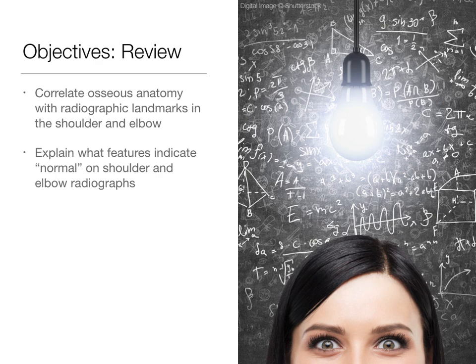So we finished our crash course on reading shoulder and elbow x-rays. This will take lots of practice to get good at, but it's a skill worth cultivating if you envision yourself working in an urgent care, emergency room, or MSK-related setting.